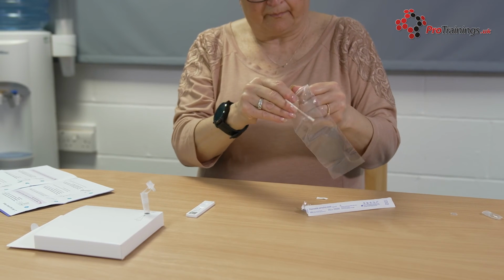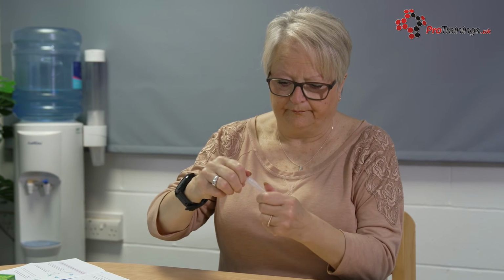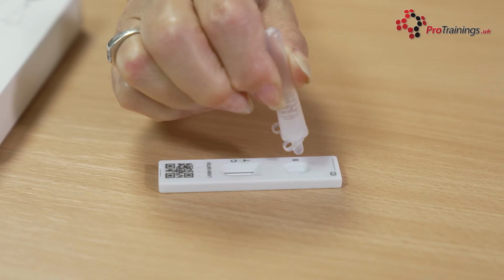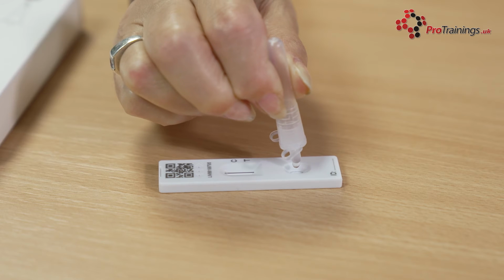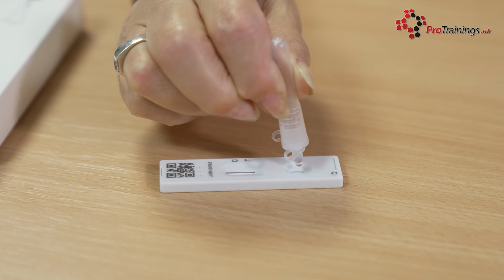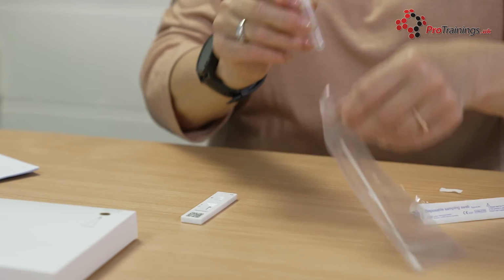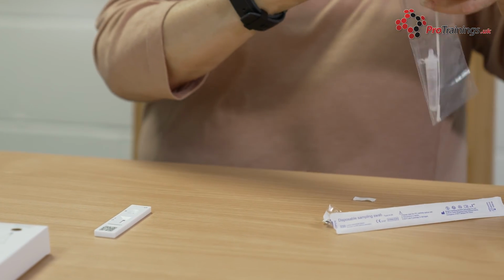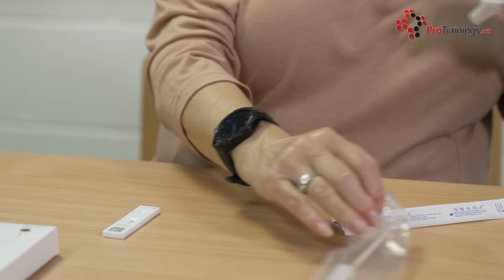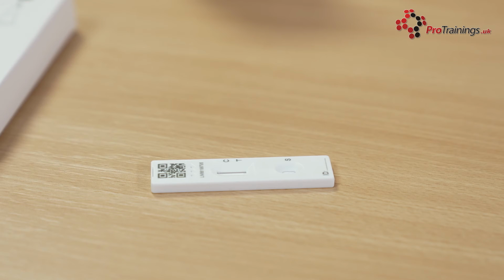Put the swab into the plastic waste bag. Press the cap tightly on the extraction tube to avoid any leaks. Gently squeeze the extraction tube to place 2 drops of the liquid onto the specimen well on the test strip. Make sure you're dropping the liquid onto the strip and not just an air bubble. Put the extraction tube in the waste bag along with the swab. Make sure the test strip is on a flat surface and do not move it during the test.